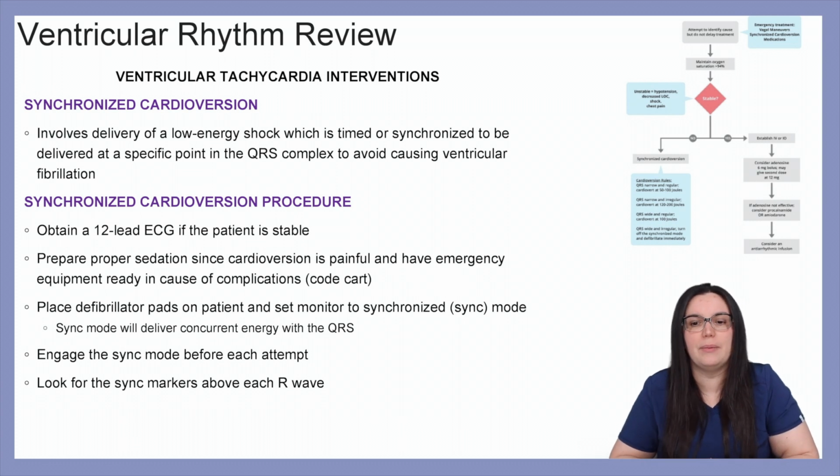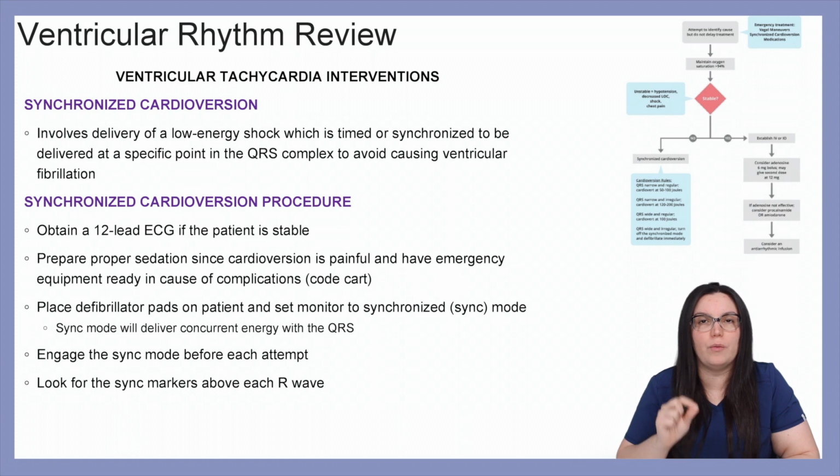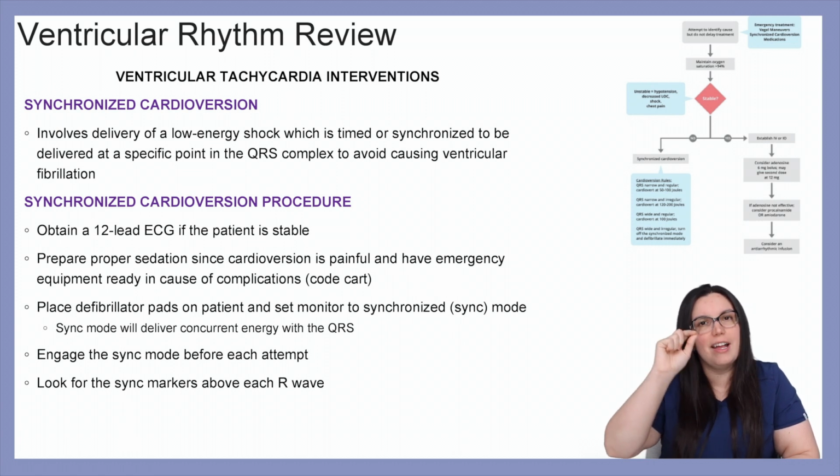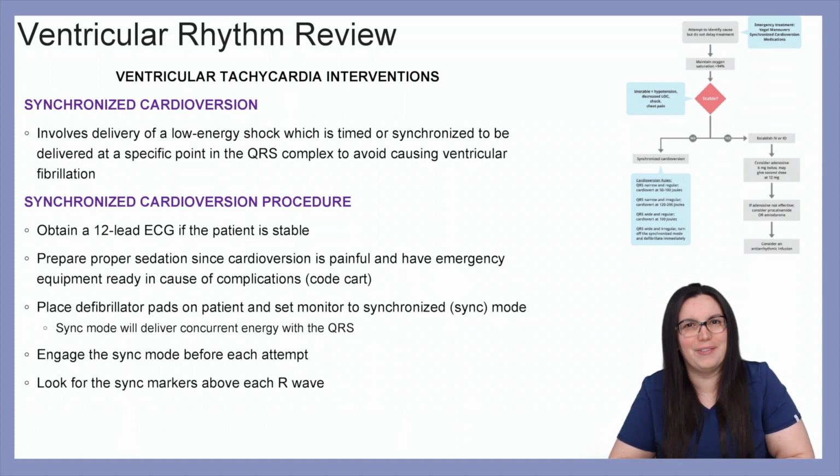We want to place the defibrillator pads on the patient and set the monitor to synchronized or sync mode. Sync mode will deliver a concurrent energy with each QRS. We want to engage the sync mode before each attempt, and we want to look for those sync markers that are going to be above each R wave.